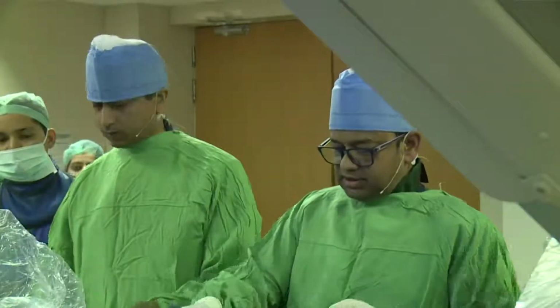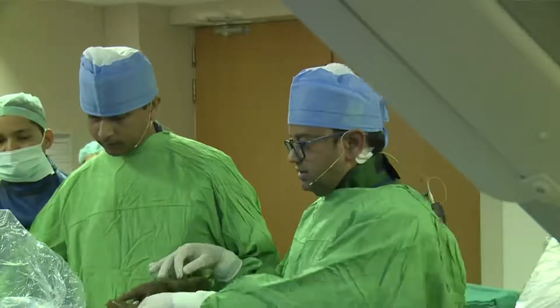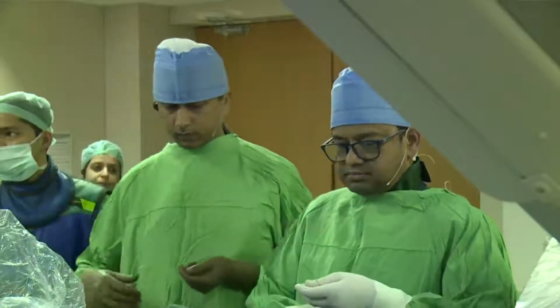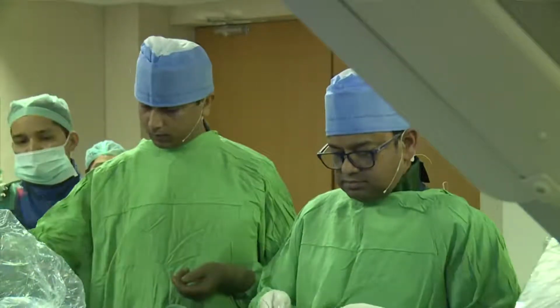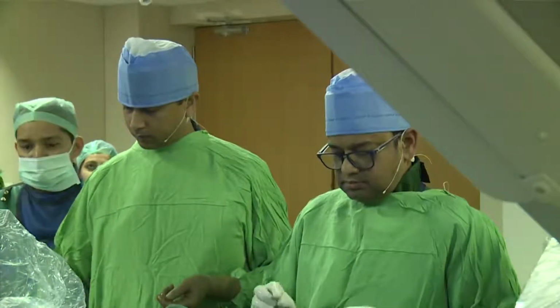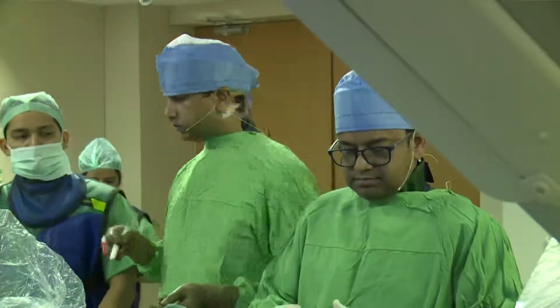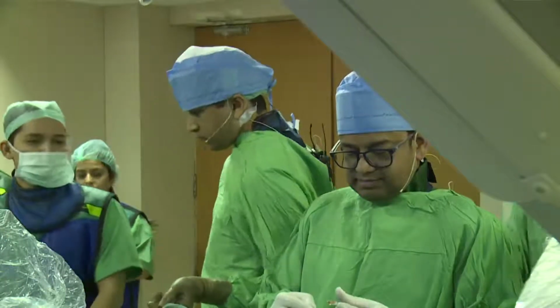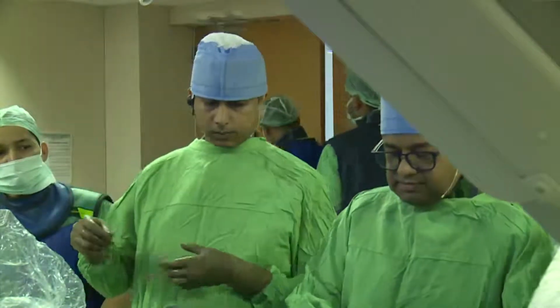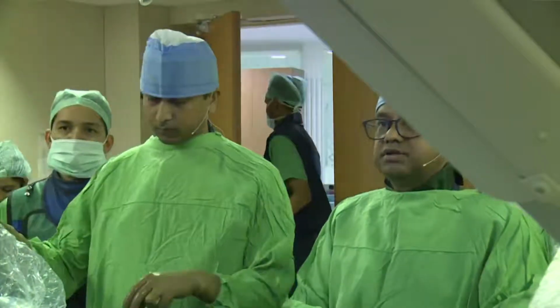So we're using another FFR wire because that tip was slightly broken. I've started to use more of the fiber optic technologies because of its durability and its steerability. Although you cannot take away that the data that we have is from the St. Jude FFR product.